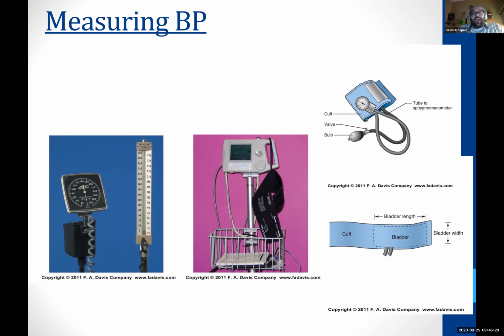Okay, fine. I asked specifically, and I will ask everyone this, what was the manual? Check a manual. Listen to your assessment skills. The manual said 124 over 86, the patient was fine. The machine had not been calibrated correctly recently. And there was no way to know that until you start thinking somebody's having a stroke from it, okay? Could be a loose cuff, could be in there incorrectly, but it turned out to be an improperly calibrated machine. So again, you find something wrong, make sure you assess it. Make sure you do it appropriately with the manual determinants.